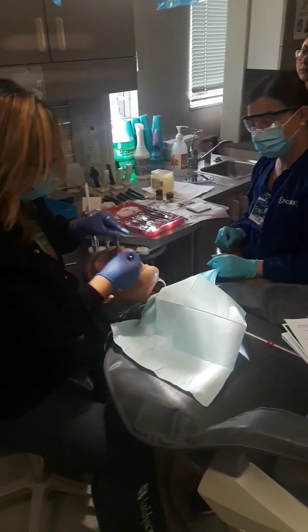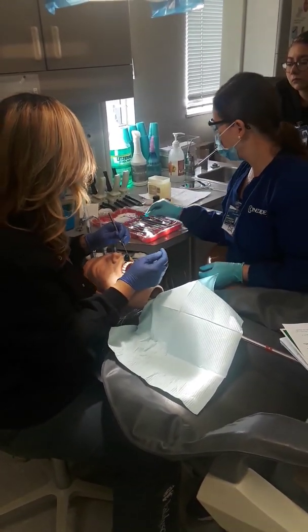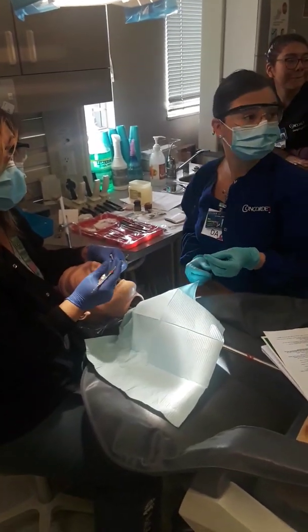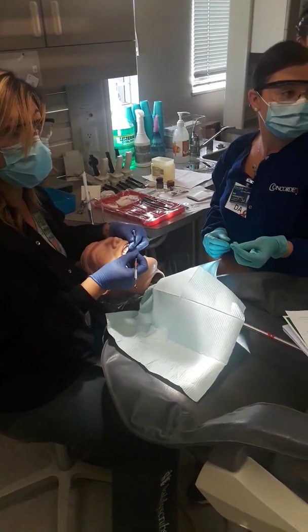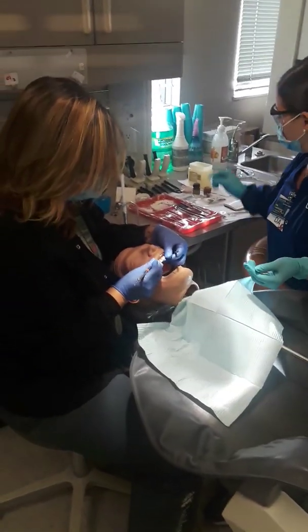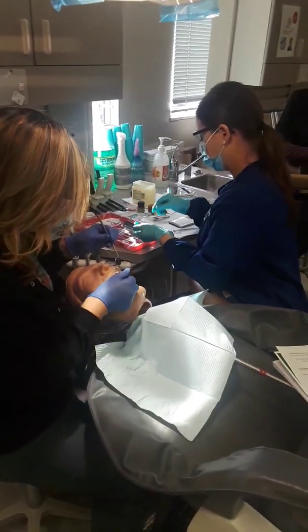Okay. I'll get ready with the temporary cement. First thing you're going to do though is pass me a spoon so I can remove my crown. Crystal, this is a bag of 500 from eBay. Wedges, you're in charge of them. They're all yours. All right, so pop off your crown with your spoon. We still have our tooth isolated.